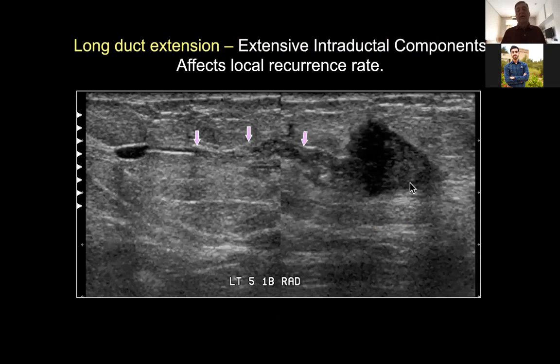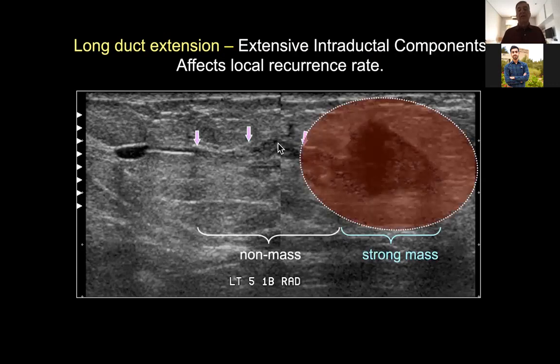Yes, I could do a core biopsy of the index lesion and say, yep, that's a grade 2 invasive ductal cancer. But if the surgeon went in and did a wide excision, there'd be a positive margin. And then if they did a resection of that margin, it would still be positive. And maybe now the surgeon might say, gee, this is too big for a lumpectomy. I have to convert this to a mastectomy.